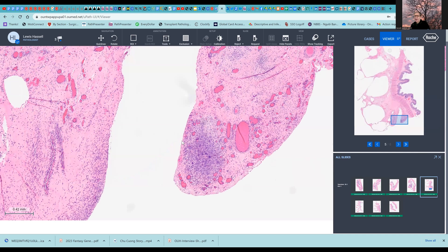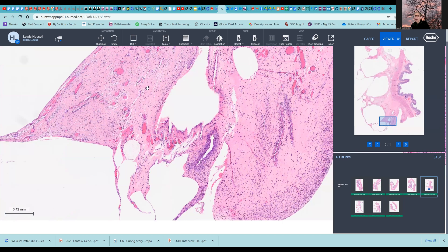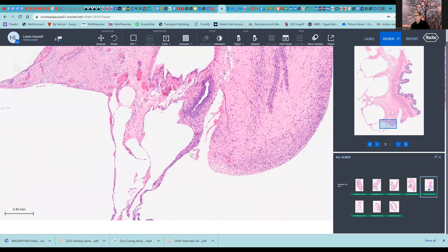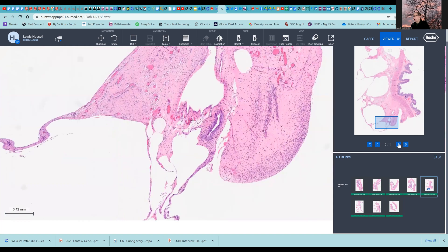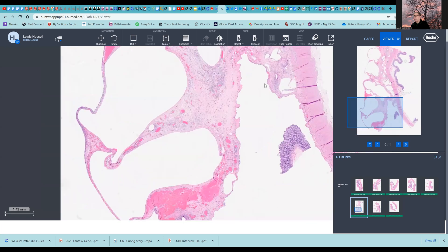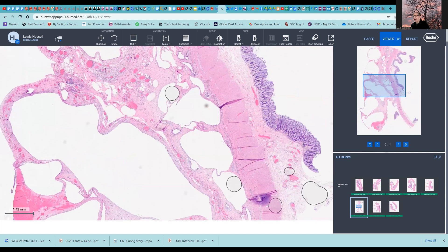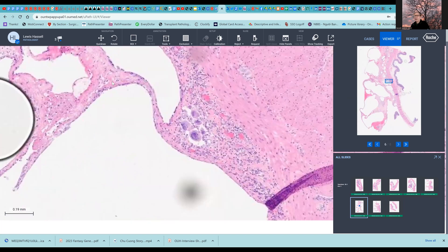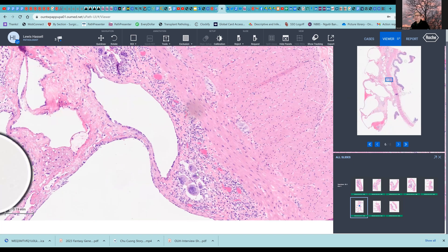As we look further, you can see again that these are very thin-walled spaces. Occasionally, you may get a fatty component if there is a release or lysis of fatty tissues into these tissues. But in general, we see just this mixed inflammatory population, thin-walled spaces, and abundant, clear, empty space. Here's another section further illustrating the variable sizes of these spaces, with some associated hemorrhage in some areas. And in virtually all of these areas, you can find little foci with multinucleate, foreign-body-type giant cells, and in general a pretty vigorous histiocytic reaction surrounding this gas, trying to diminish or digest it.